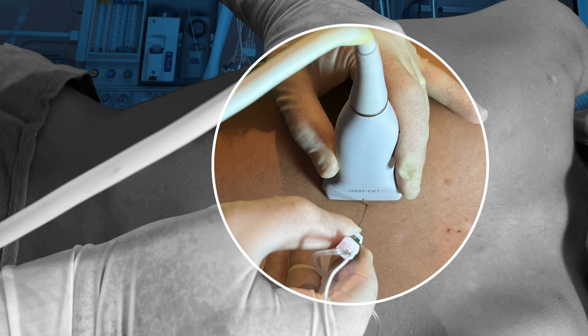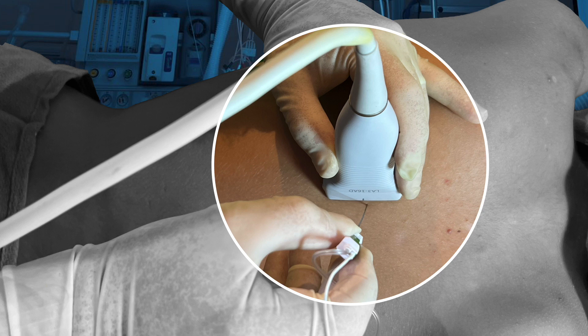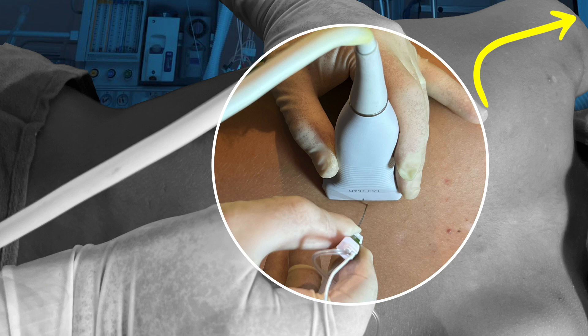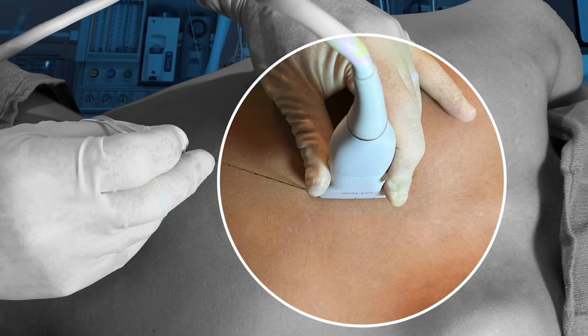We can do this block in several positions. Sitting and prone are common options, but our preference is lateral. It allows you to stretch the patient's arm forward and/or over their head to improve access to the posterior chest wall, and you'll have easy access to do both out-of-plane and in-plane approaches.